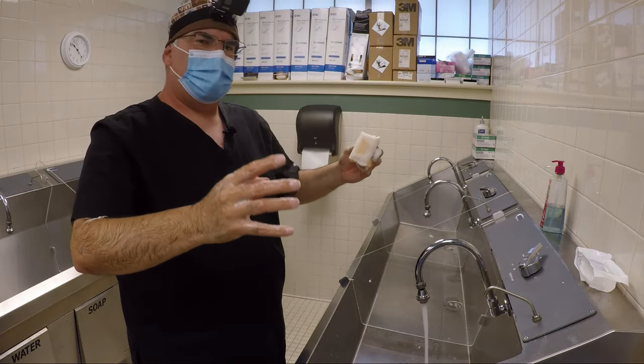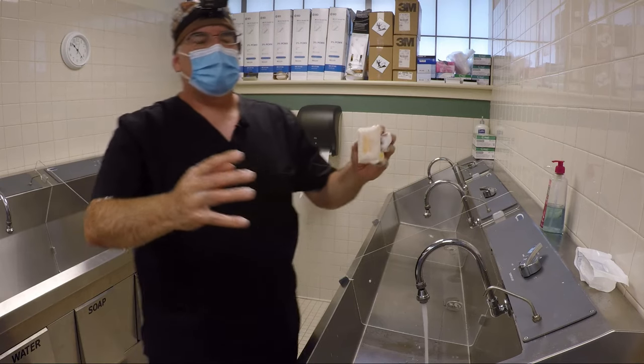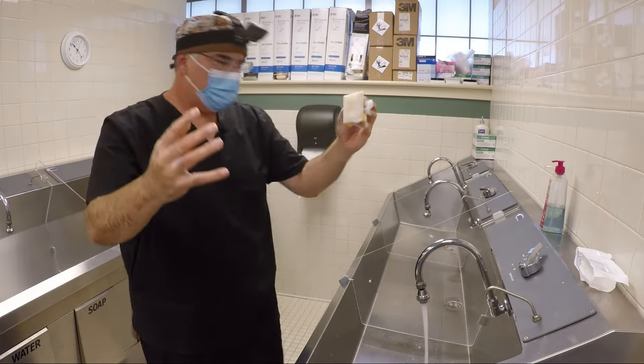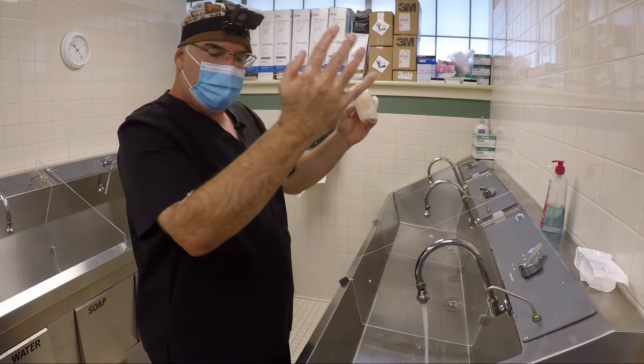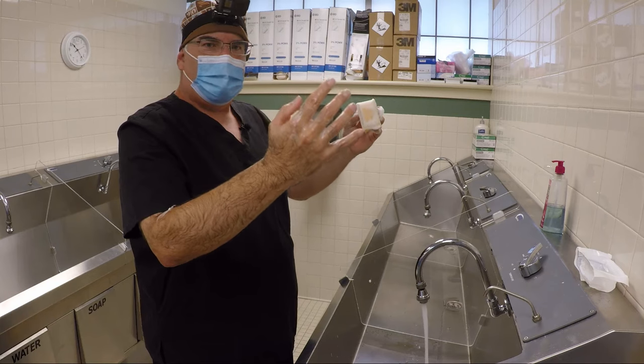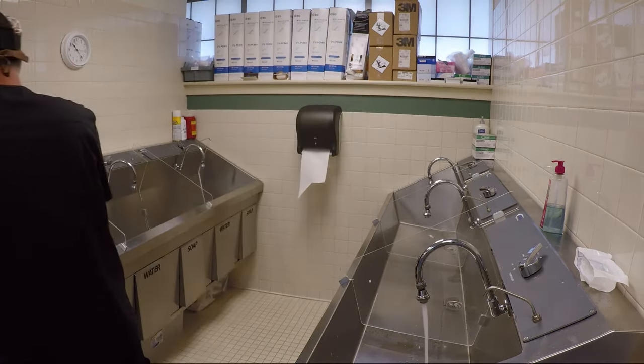What you'll see a lot in the clinical sites is people will throw the sponge into the sink. That's not really nice. So we want to throw the sponge away. Again, notice how I'm holding my arms. My fingers are still pointing upward and my elbows are still down. So any water is going to drain off of my elbows. So I'm going to carefully come over here and throw the sponge away.